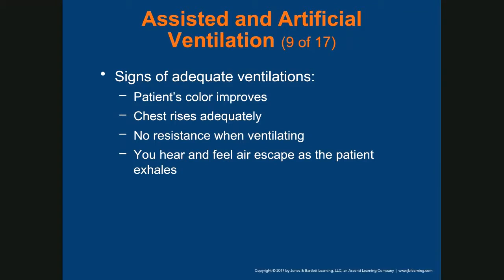There should be no resistance. In other words, when you squeeze the BVM, you shouldn't feel a back pressure. You shouldn't feel a pressure pushing on the mask. If you feel a pressure when you squeeze the BVM, it means that the airway is not properly open. If you can hear and feel air escaping, then your technique is good, right? No resistance, visible chest rise, color should improve.